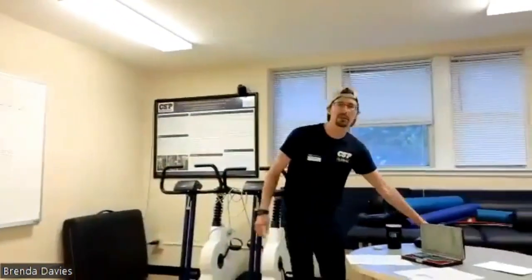The next one that we're gonna do, because again, Anna was the one that we did bod pod with, and we've done height and weight with, is bioelectrical impedance. Did you fast for 2 hours? Did you go to the bathroom before? Yeah, pretty close.